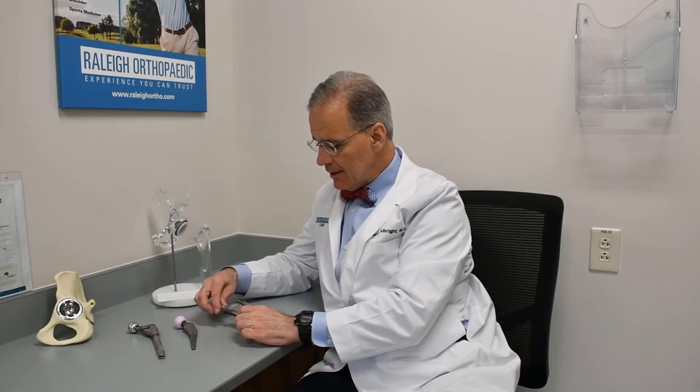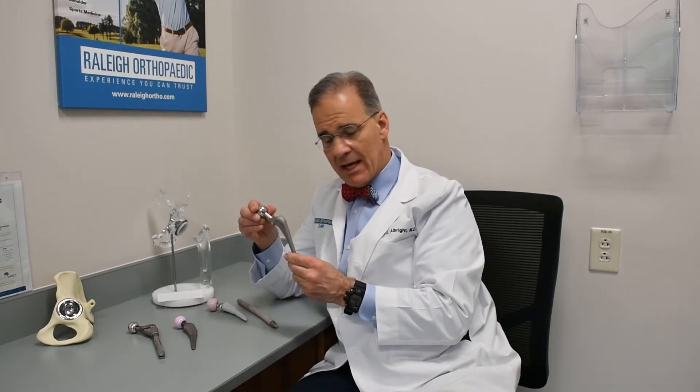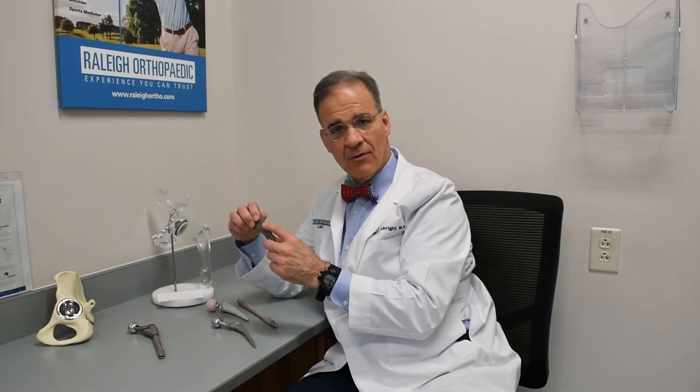There are a lot of exciting materials we use: cemented stem, uncemented stem, porous ingrowth, and different shapes depending on the anatomy and your specific problems. We can custom fit what you need based on how your bones and your joint look.